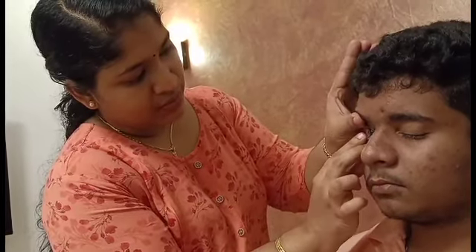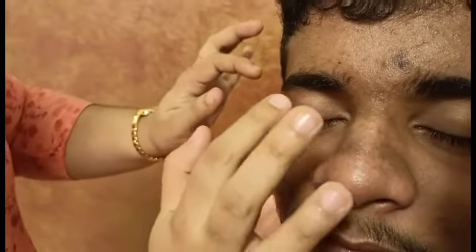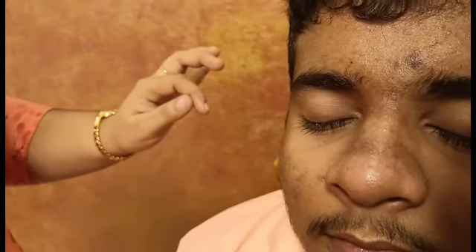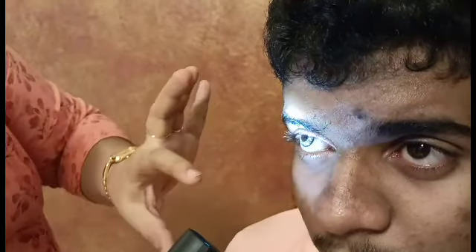Use your finger to keep the lashes out of the way and massage gently. Use the right side, then the left side, and keep the lids aside. Once the lens is inserted, look ahead and assess corneal coverage. It is normal to cover 1mm to 2mm beyond the limbus. Check that the lens properly covers the cornea.